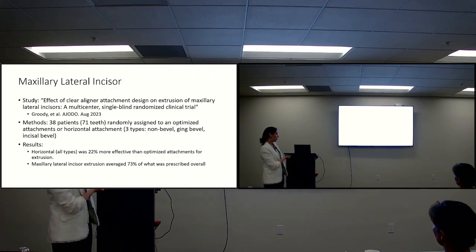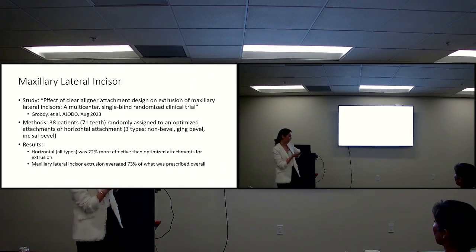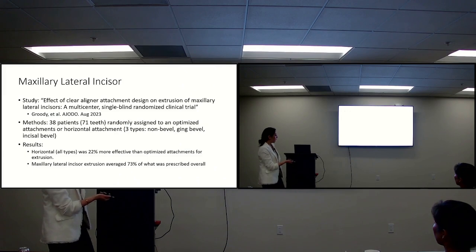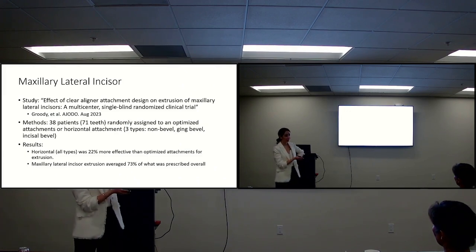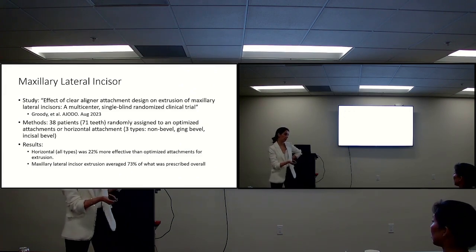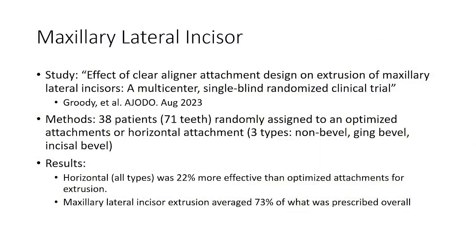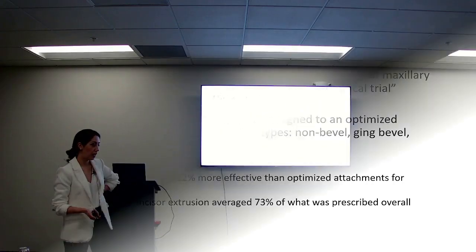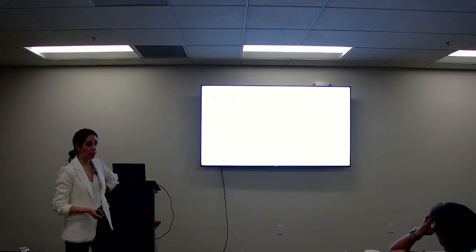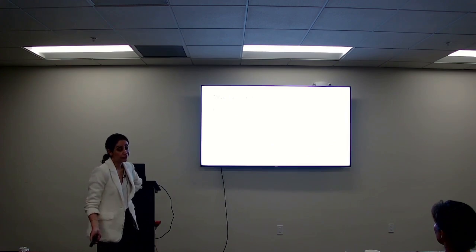If you go to lectures with Jonathan and Maz Mashiri, those are like the big Invisalign speakers, they don't even use optimized attachments. But then there are other Invisalign speakers, one is my mentor, she only uses optimized attachments. So there's no clear answer. Everyone has their own recipe when it comes to Invisalign, and I don't think one way is right and the other is wrong. In my experience, the longer I'm in practice, the more Invisalign cases I do, the more I realize optimized attachments don't work as well.